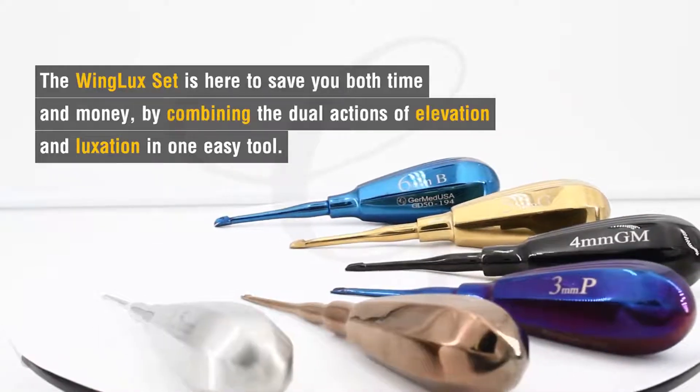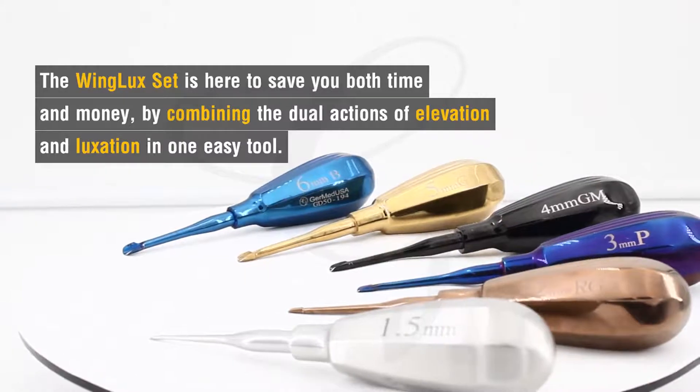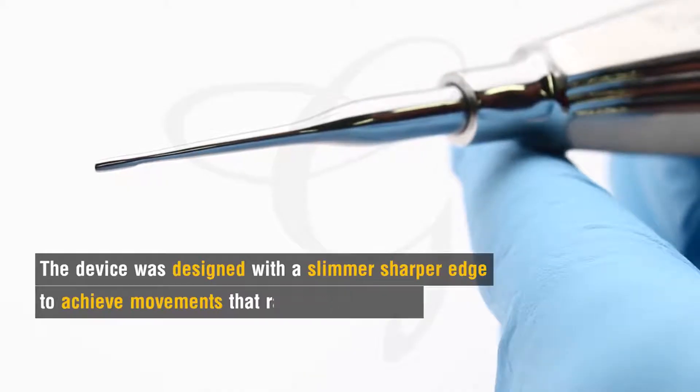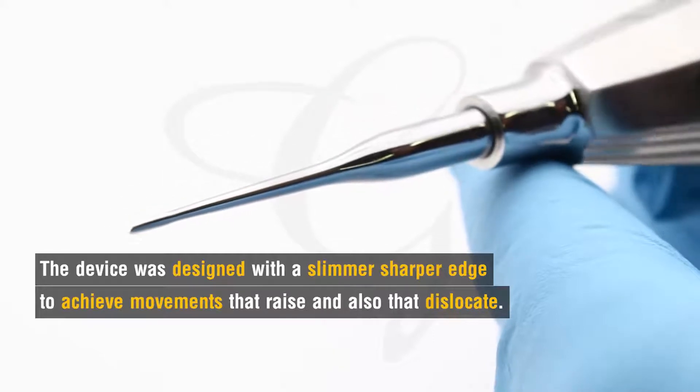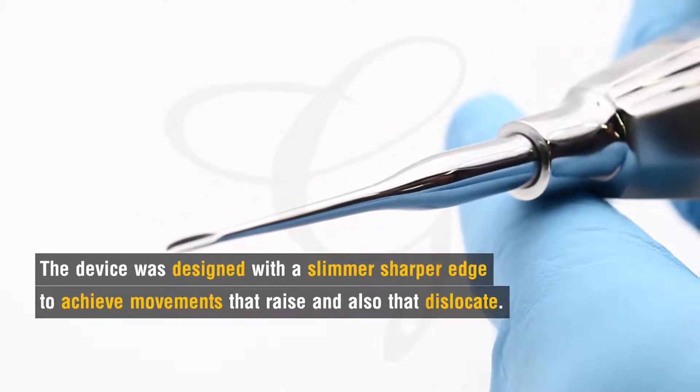The WingLux set is here to save you both time and money by combining the dual actions of elevation and luxation into one easy tool. The device was designed with a slimmer, sharper edge to achieve movements that raise and also that dislocate.